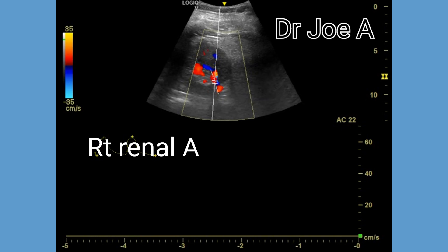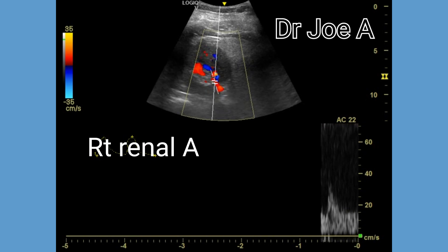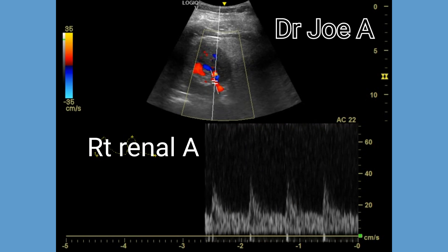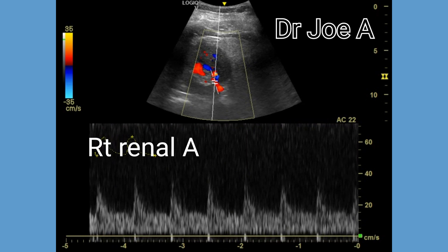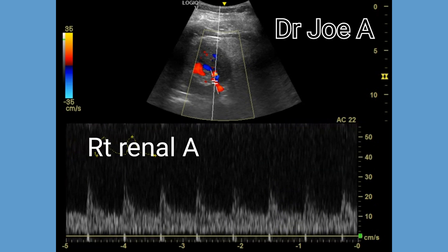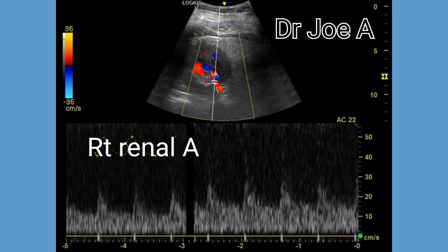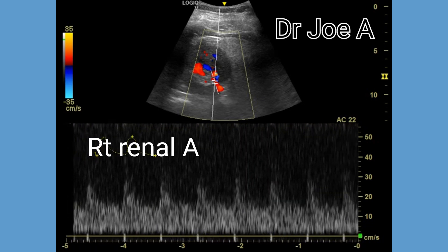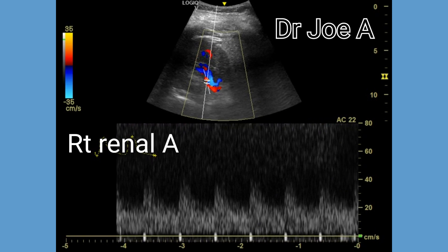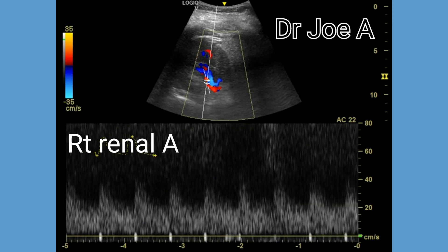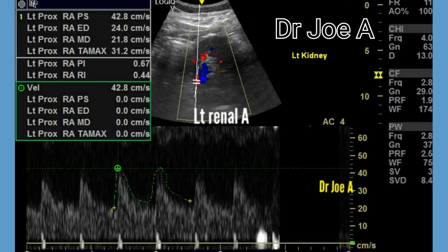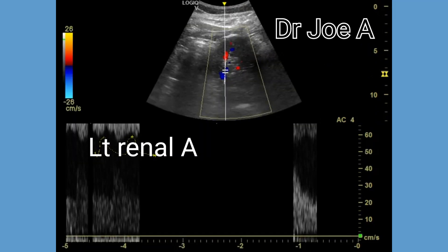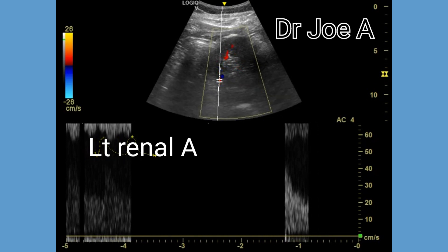A lot of patience is required to obtain a proper spectral Doppler study of the renal arteries due to patient movement, especially breathing movements. Whilst doing a renal artery Doppler, it is important to avoid the renal veins as this may cause an artifact and an improper spectral Doppler tracing of the renal arteries.